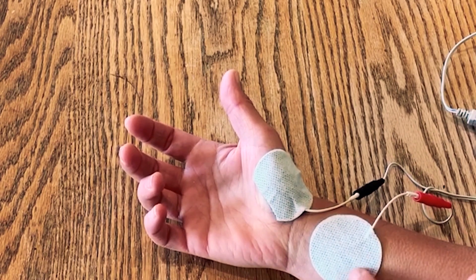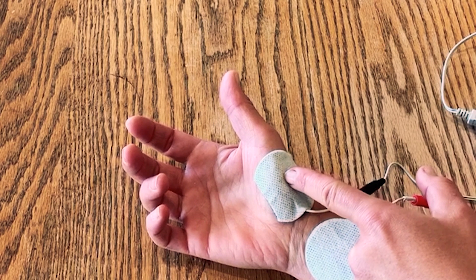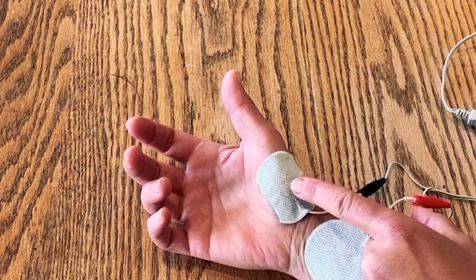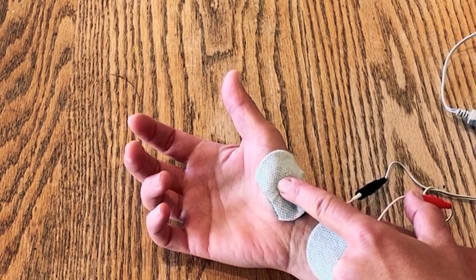I've used a standard two-inch round electrode and just trimmed the edges for this, so that I just pick up the activity I want. You could also use a 1.25-inch round — a smaller electrode — for this purpose.